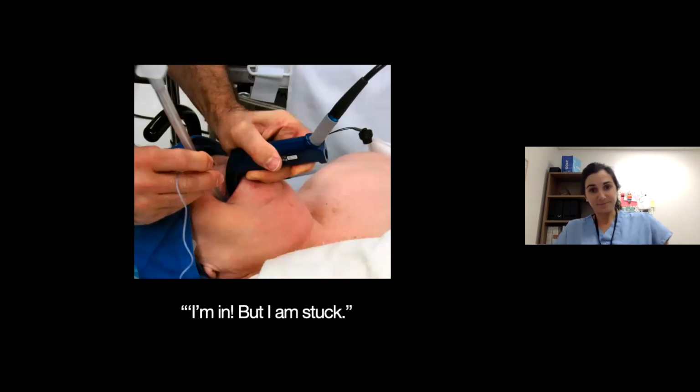Pitfall number 3. You're in. So you have successfully done all those maneuvers. You've entered with the right approach angle. You've created some space with your Glidescope. You're in the cords, but you're not able to put it through the cords. And that happens all the time. And it is actually normal because that's the whole nature of the Glidescope, but also the rigid stylet.